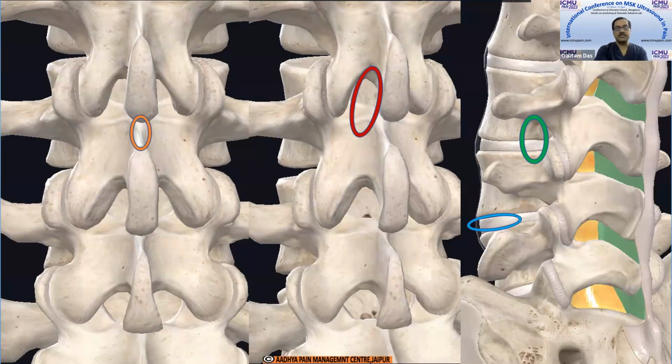Next important space is between the two lamina. So in between the two lamina, if you are holding the probe a little bit oriented towards medially, this is another very important space, the interlaminar space. We can peep and we can see inside the spinal canal. Another important space where we can go through and see something is your transforaminal area between the two pedicles, and we can look through the foramen inside the spinal canal.